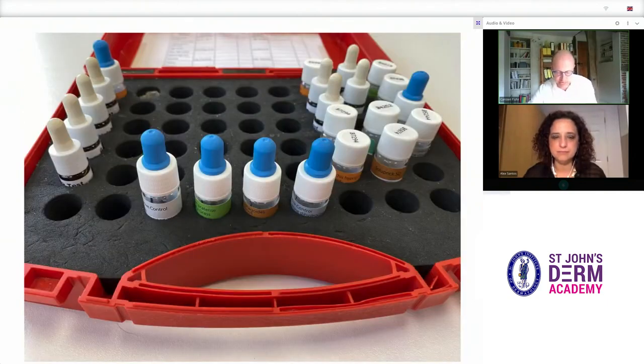This red case stores all the allergens. In practice, we tend to keep the bottles in the case while we conduct the test to avoid them tipping over.